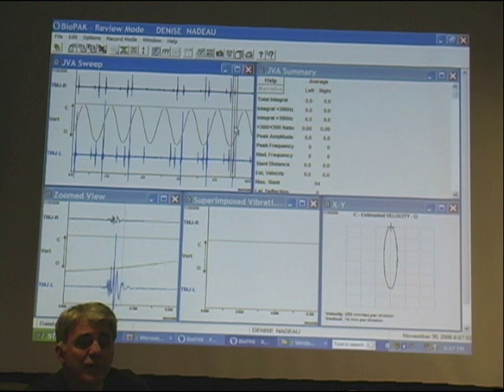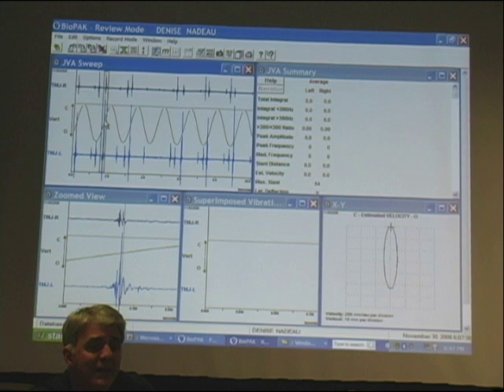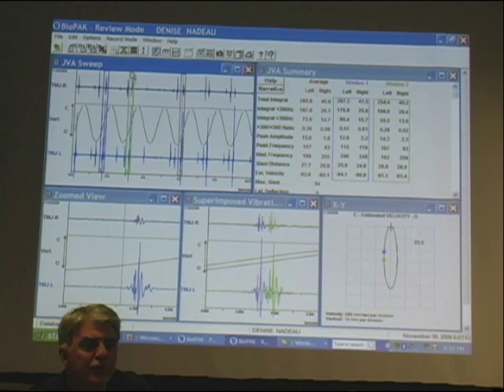Now I can go ahead and pick up similar vibrations. I'm going to pick up all the closing vibrations, that big one at the end, and I'm going to mark it and pick up another one. See how I'm picking up the same vibration and marking it.